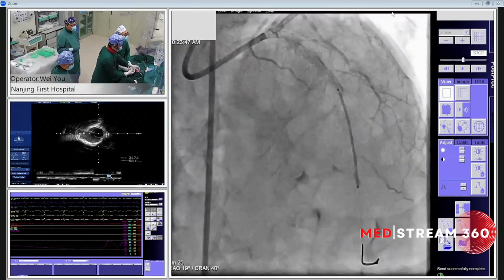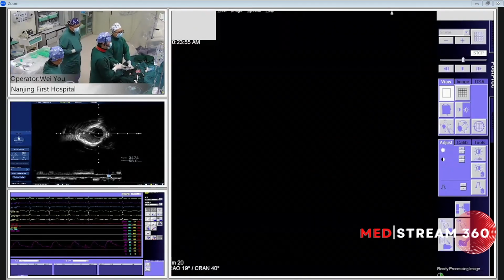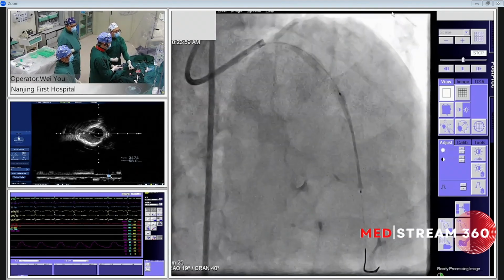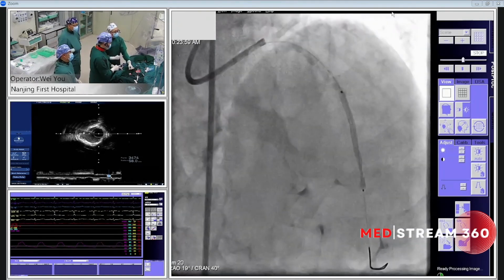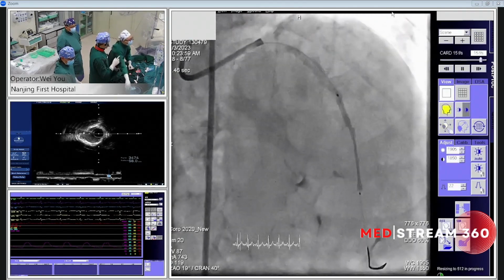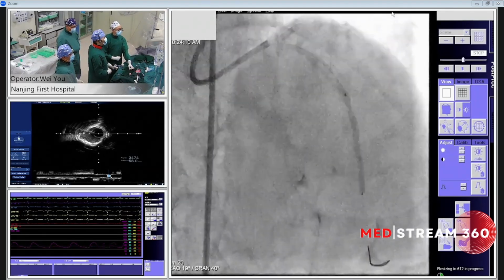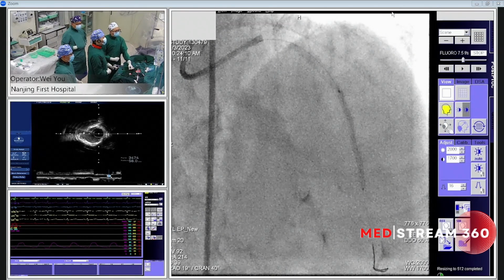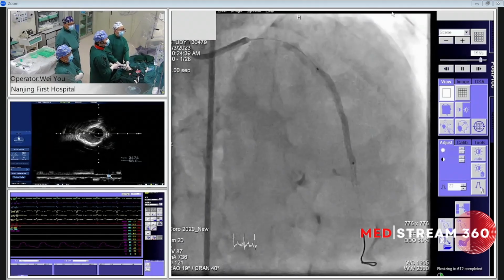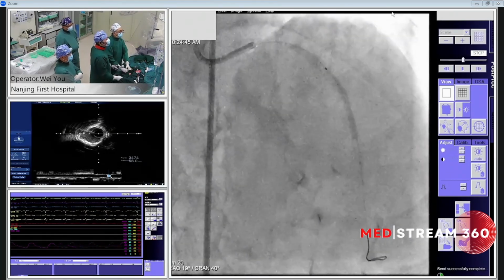So Chief, I think here is okay, just the last diagonal. Okay, just inflate. Inflate to 6, 8. What's the nominal pressure? 10. Long time inflation, at least 15 seconds. For a long stent, long time inflation can achieve full stent expansion. It's very important. We still use a stent balloon to do the post-dilation up to 12 atmospheres.